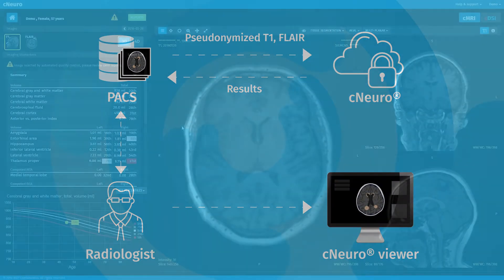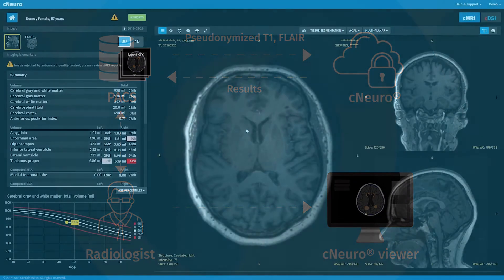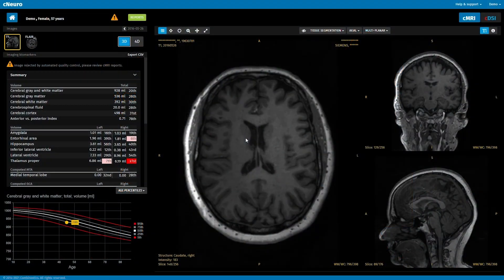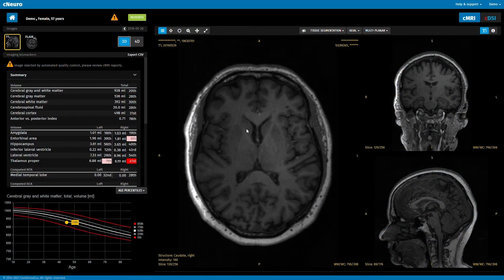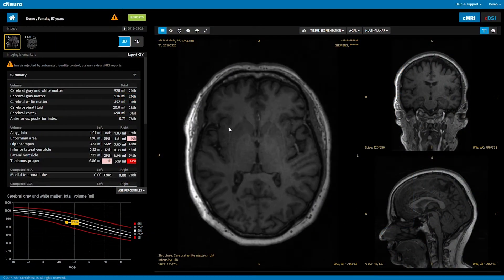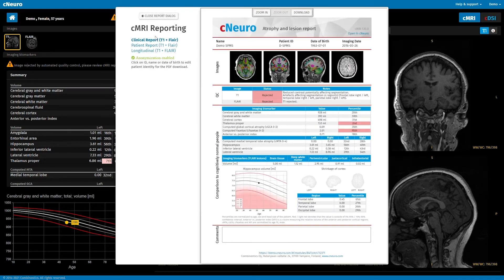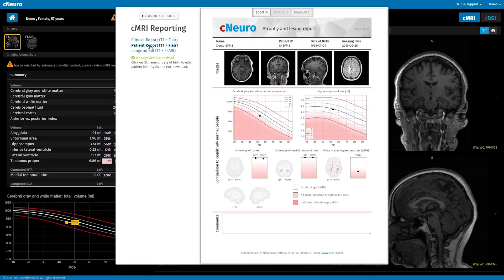Here, we see data from a patient with secondary progressive multiple sclerosis. CNeuro-CMRI provides multiple reports: a cross-sectional clinical report, a simplified patient-oriented report, and a longitudinal report.